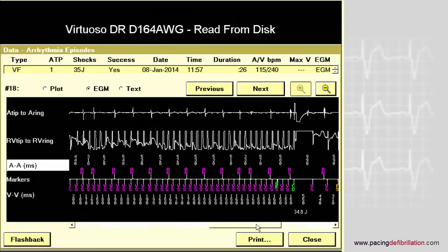This case illustrates the risk associated with T-wave oversensing. The patient can receive inappropriate therapy, and these inappropriate therapies, a burst or a shock, can be delivered on the T-wave. There is a 50% chance that the burst or the shock is delivered right on the T-wave, so in the ventricular vulnerable period, with a risk of induction of this kind of very dangerous and polymorphic arrhythmia.